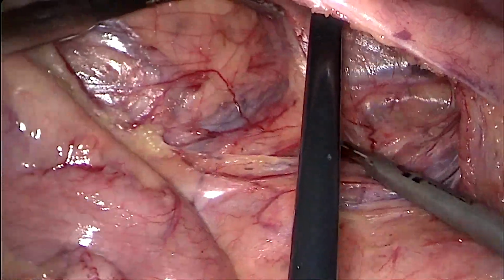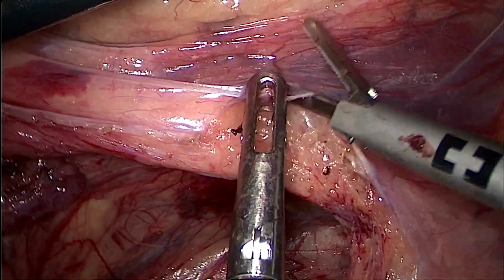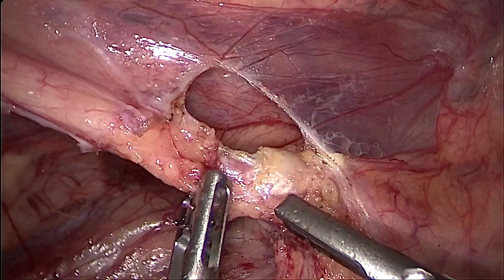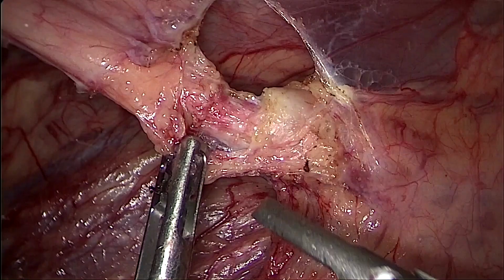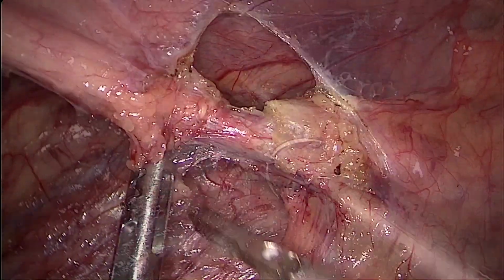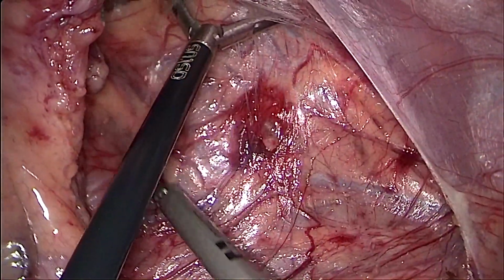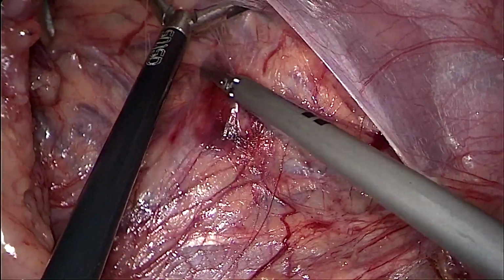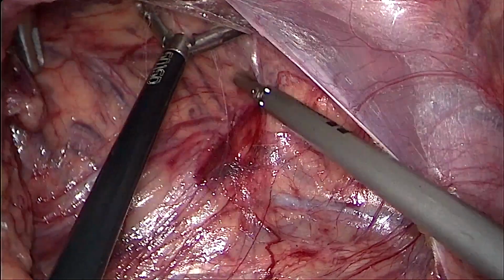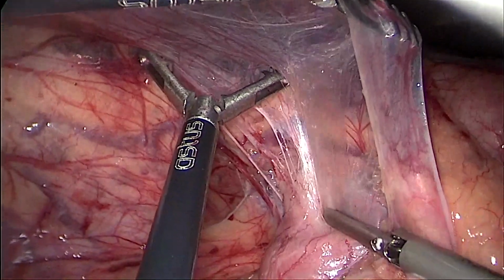We like to start on the right side of the bowel. So we started resecting the ileocecal vessels and ligating them. It's our preference to do it this way, because we think it's easier to go from the right to the left. We will do this right side resection, the medial to lateral dissection, in the plane. Now we will find the duodenum.